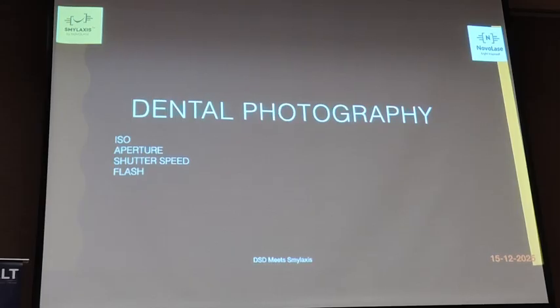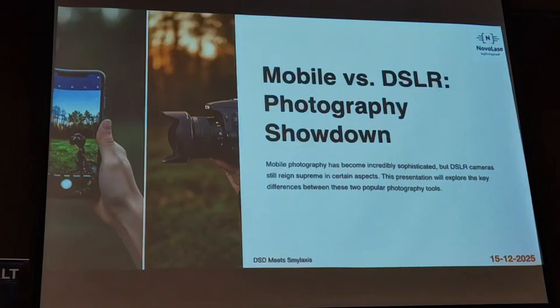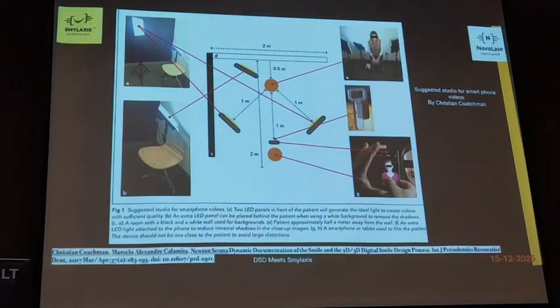If you go too close to the patient's face, what happens? Your nose and mouth will look bigger and the ear will look very small. Got it? That is why we use a DSLR, where the aperture is good and you get real pictures. Okay? I'll not waste time with this. I'll just show you a few settings.